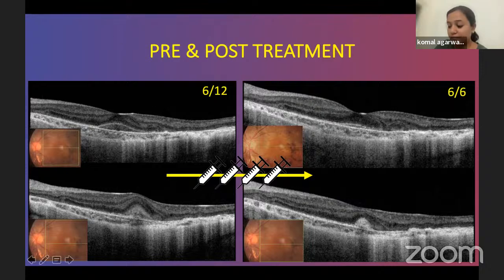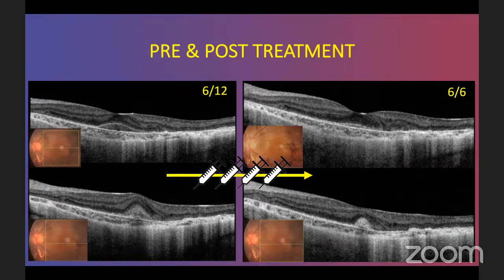Dr. Shishir? Yeah, so I have some experience in treating these dystrophies, especially choroideremia, and we have treated 4 eyes with Best disease. And like you correctly mentioned, in Best disease sometimes it's quite difficult to know whether it's actually a network which is subfoveal or whether it's the vitelliform deposit, especially even when you do an OCT, you don't really know. So there the OCTA really helps in differentiating whether it's a network or whether it's a vitelliform material.